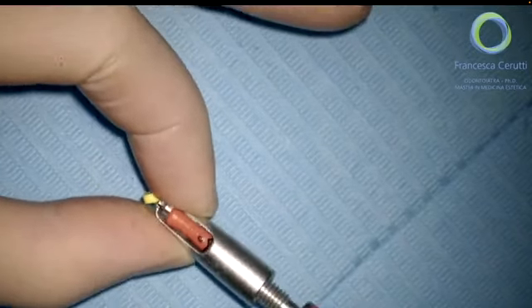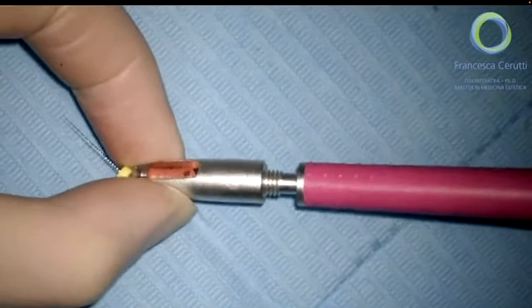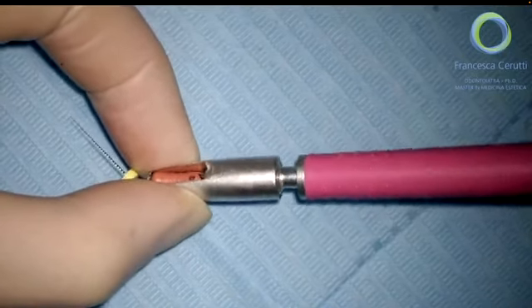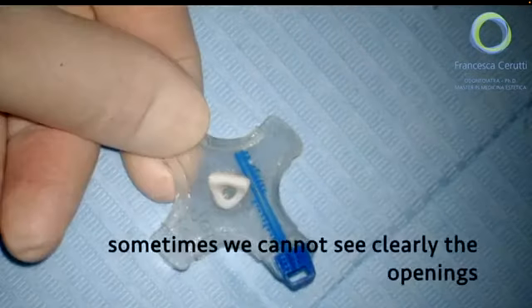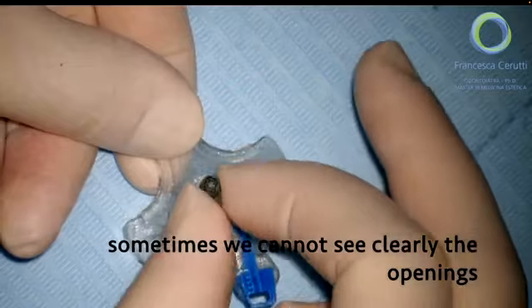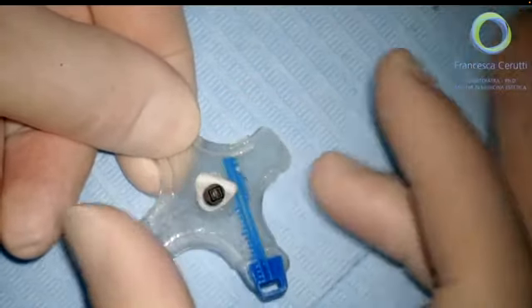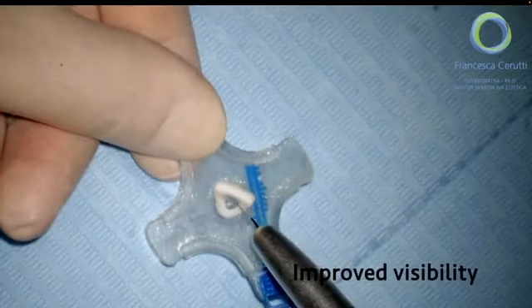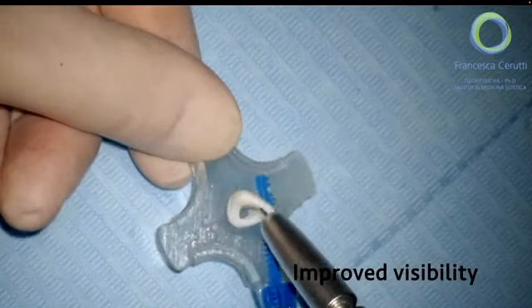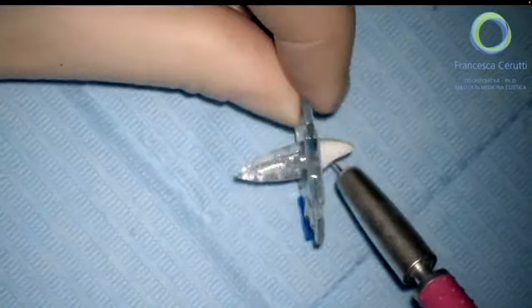Later, I'm showing you a video in which I'm doing it manually while I'm working because I'm managing more root canals. But if you are able to pre-bend it before, it's easier. And you can also position the stop in order to remember where the curvature is if you pre-curved the tip of the file. Because sometimes, as you are seeing in the video, when we are working with the hand, we are not seeing the access cavity and we are not seeing what we are doing.